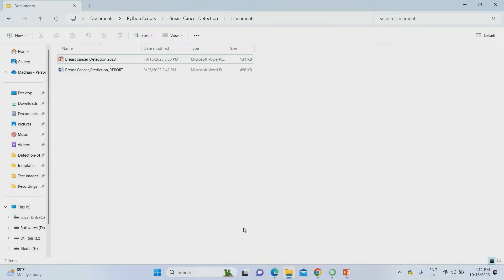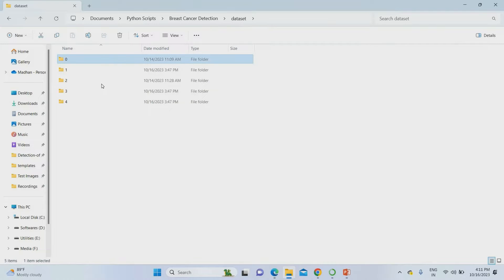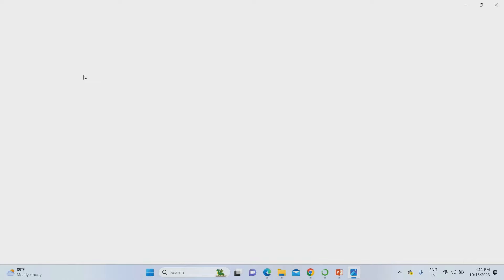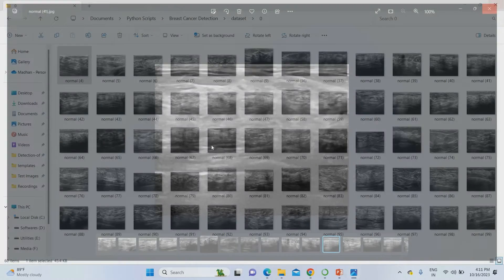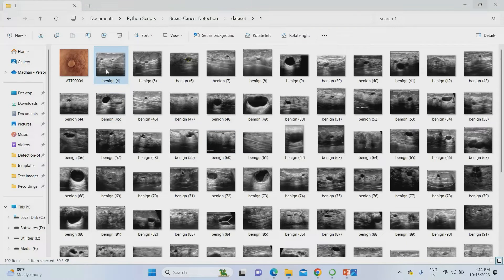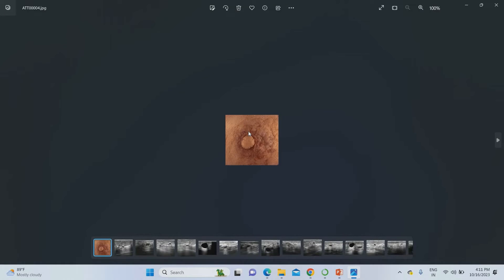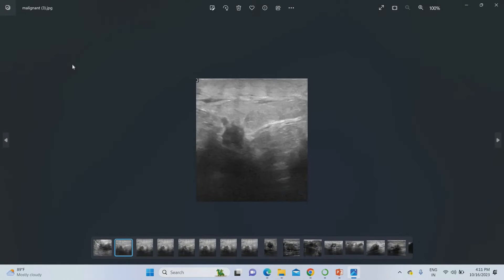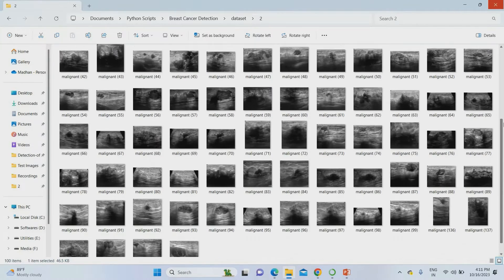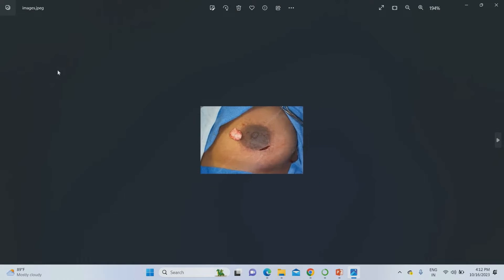Without wasting further time, let's run this project. The dataset has four to five stages: stage 0 is normal with no tumor — these are ultrasound images of the breast. Stage 1 is a benign type. You can use normal breast images or ultrasound images — it will work perfectly. Stage 2 is the malignant type. Stage 3 is also shown — these are the breast cancer ultrasound images, and you can use any sort of images here.